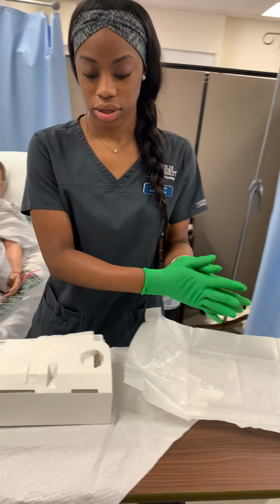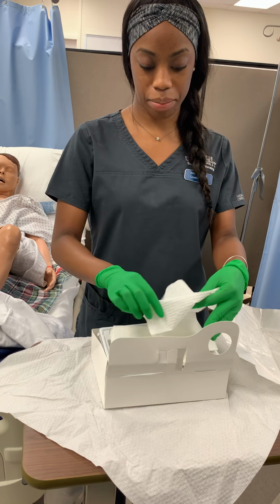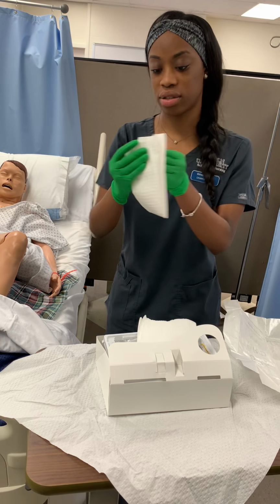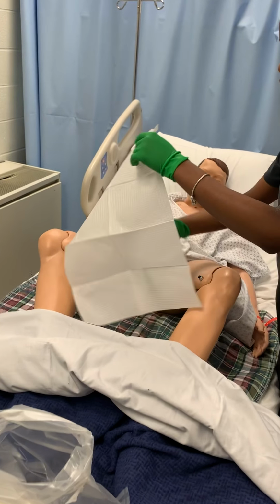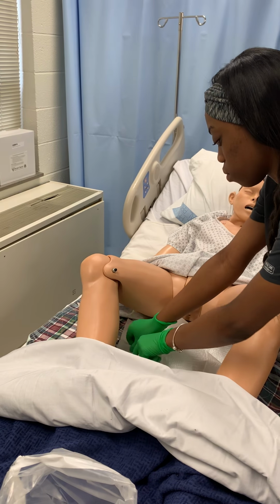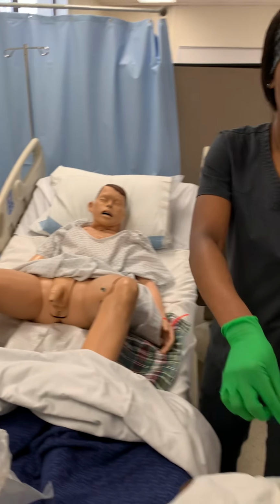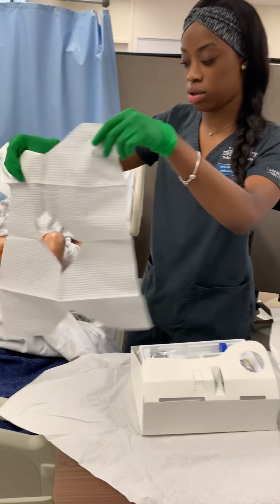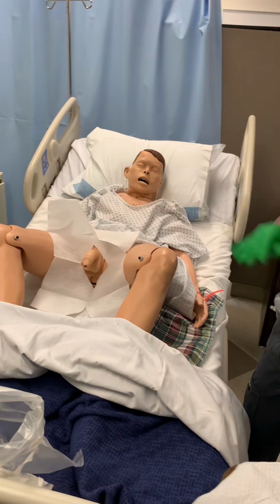Now I'm going to place the drapes, using correct draping. This is the barrier you want to put underneath your patient. Make sure I don't touch anything. Next, this one you put around your patient's area. Okay, we'll fix that later.